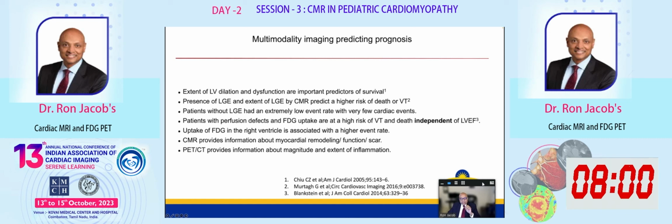A couple of pearls here that I will tell you. The extent of LV dilation and dysfunction are obviously important predictors of survival. The LGE individually predicts a higher risk of VT and of death. There's really not too much value in following the LGE. Once you have a certain burden of LGE, after treatment, following that has not too much value because it remains relatively unchanged. Your risk of VT is predominantly mediated by that. Patients without LGE generally have a low risk of events.